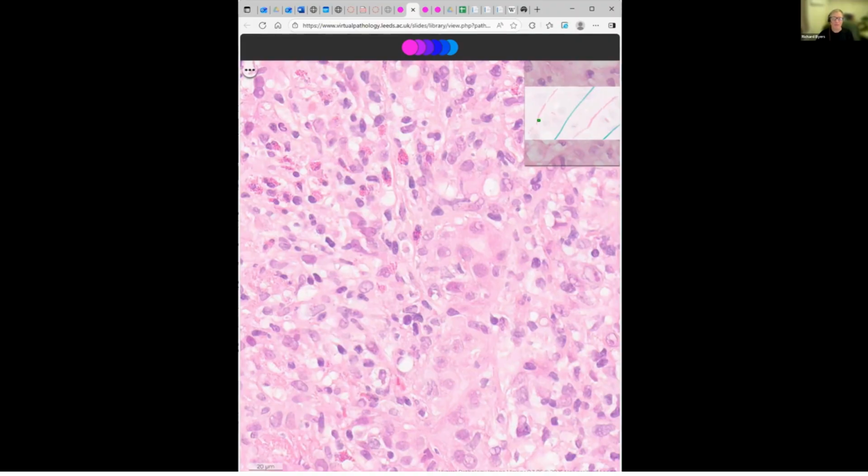No? Anyone want to stick their neck out? Put anything in the chat? Oh, okay. Portal. So you've got portal based. So you've got eosinophils and lymphocytic infiltrates. That's really good. I don't know, Ava, if you're able to unmute people. People might want to talk instead. I don't know how easy that is to do. I think they will come up as panelists, so I'm not sure if I can do that.